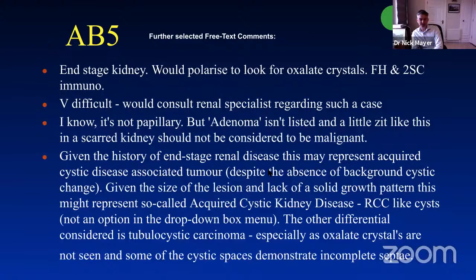And then another lengthy comment, but again, a very useful comment, raising the possibility of these so-called acquired cystic disease RCC-like cysts, which have been recently described as the likely precursor lesions of acquired cystic disease RCC, which show quite considerable morphological and immuno overlap with tubular cystic carcinoma.